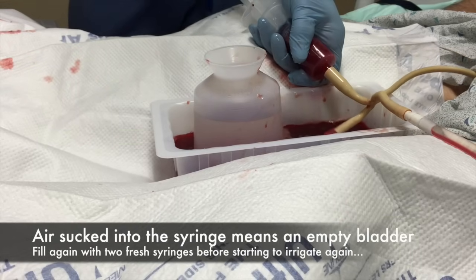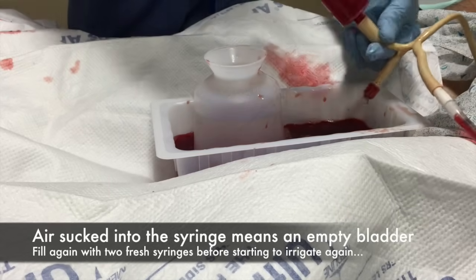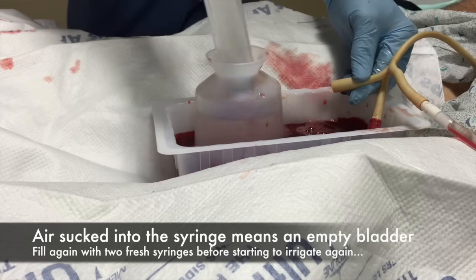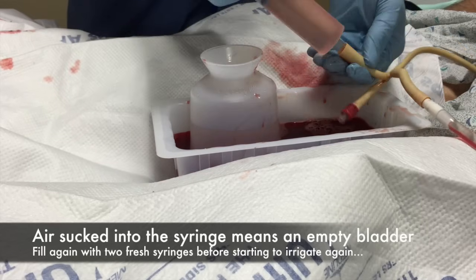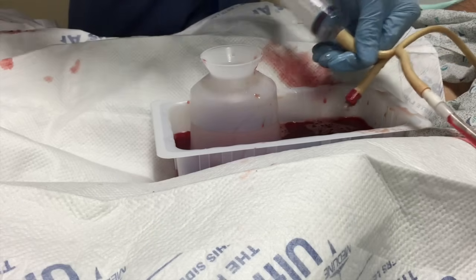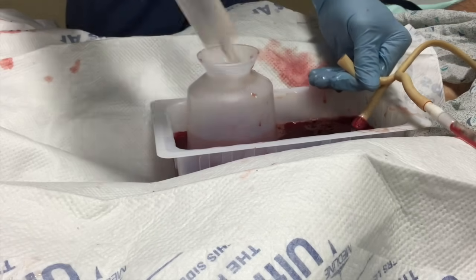Again, start with two fresh syringe fulls with your thumb in the ring of the piston, gently in and out, and always make sure that you tighten it into the end of the Foley so you don't push the Foley off the tip of the catheter.